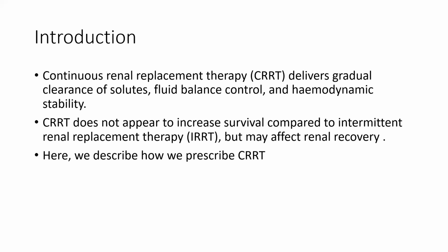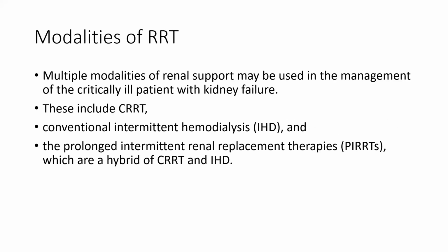Continuous renal replacement therapy delivers gradual clearance of solute, fluid balance control, and hemodynamic stability. CRRT does not appear to increase survival compared to intermittent renal replacement therapy, but may affect renal recovery. However, we are describing here how to prescribe this CRRT.